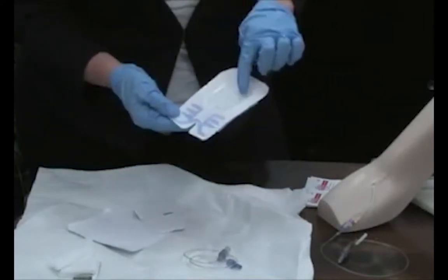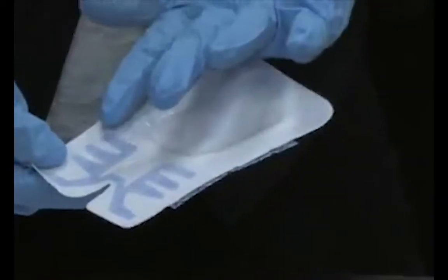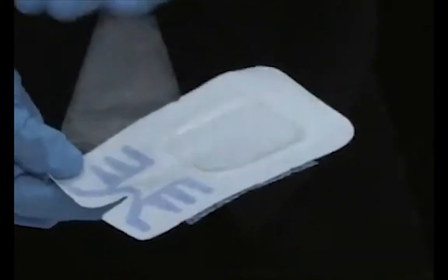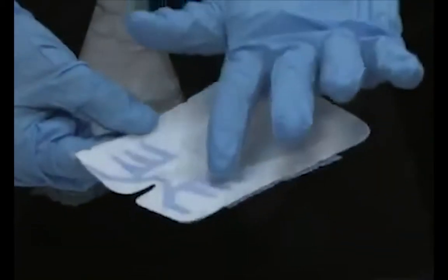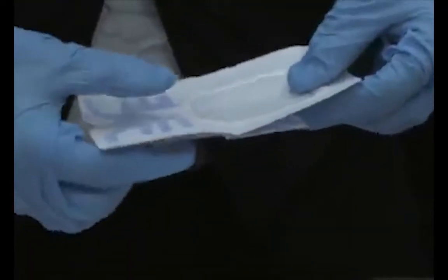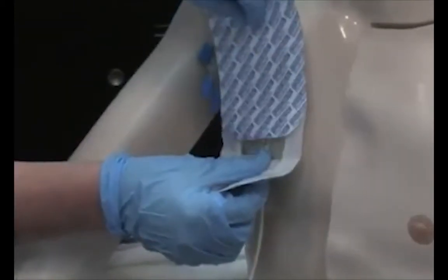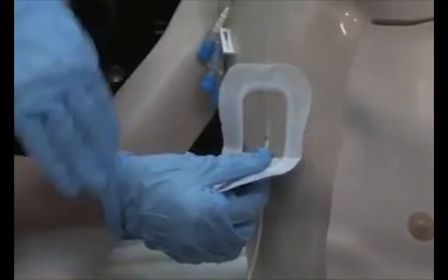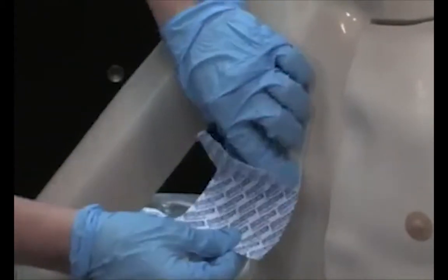The middle window area, of course, allows you to see the site and allows the site to breathe. The outside area wicks away any moisture or anything, because the patient, of course, is going to sweat or perspire. And then this secured area here keeps it from pulling on the site itself. So when you're placing it, like so, it is very, very easy to apply.